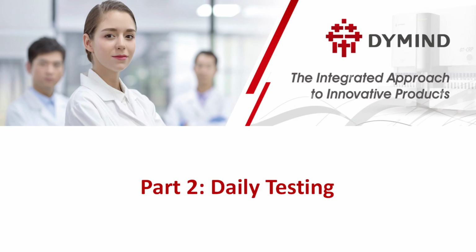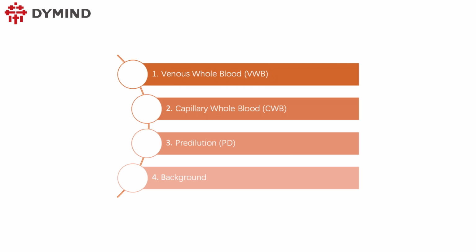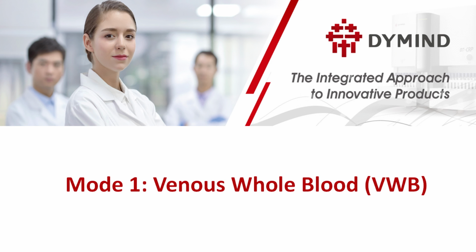Part 2, Daily testing. Daily sample testing is divided into 4 modes: 1. Venous whole blood, 2. Capillary whole blood, 3. Pre-dilution, and 4. Background. Mode 1, Venous whole blood.